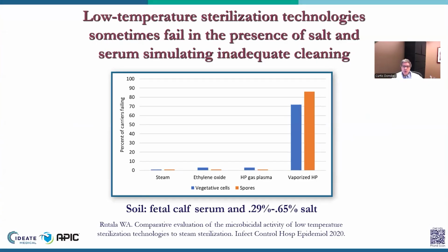So why are we interested in challenging the technology? It is because low temperature sterilization technologies sometimes fail in the presence of salt and serum, which simulates inadequate cleaning. And it's essential to do this type of testing to show the importance of adequate cleaning. So here's some data from Dr. Rutala, where they used a soil load of fetal calf serum and salt.